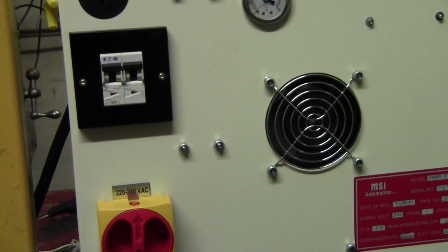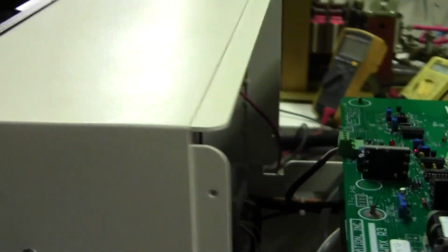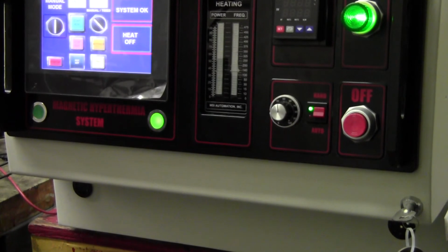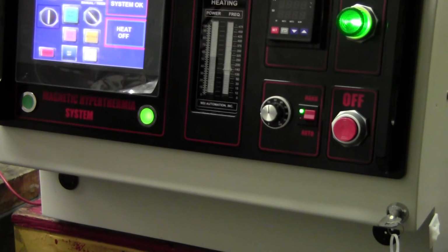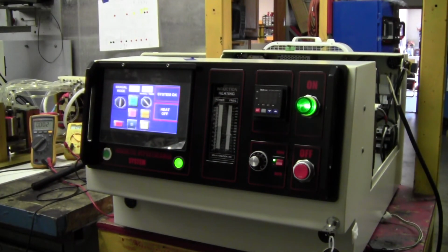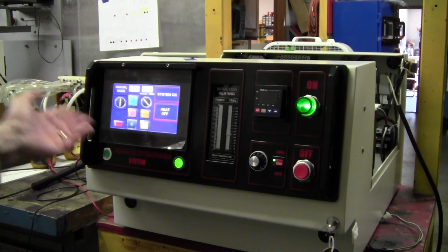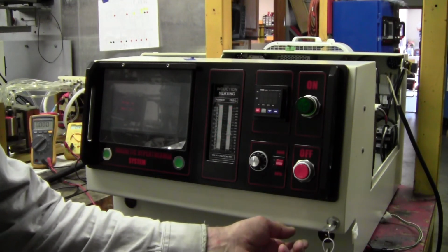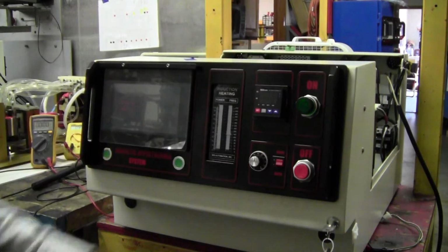All right, I've shown you pretty much everything I can think of. If there's anything else, I'll send it as an email separately. I'm very busy. So, okay, when you don't want to use the machine, obviously you just turn that. You can take the key out, and you can flip the circuit breaker on the back side down.